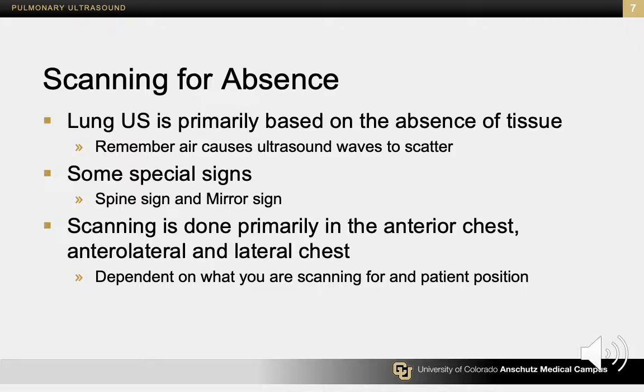So we'll talk a little bit about imaging the lung, and really what we're doing when we're imaging the lung, because it is air-filled, is imaging the absence of pathology. If you remember from previous scanning sessions and lectures, air does not conduct ultrasound waves well. It tends to scatter.